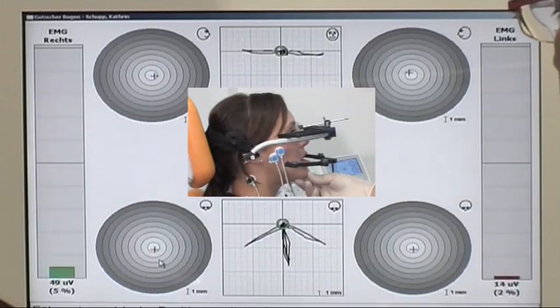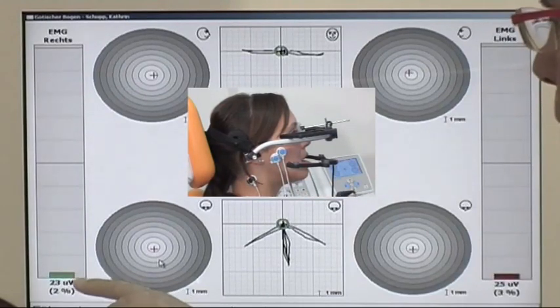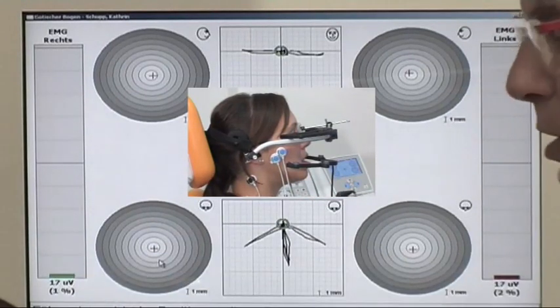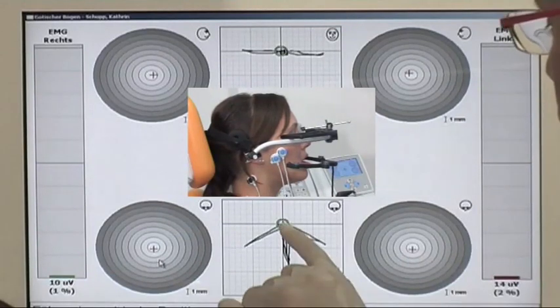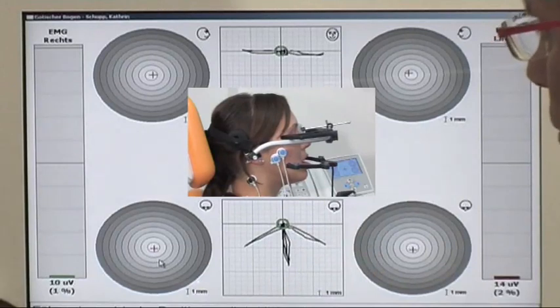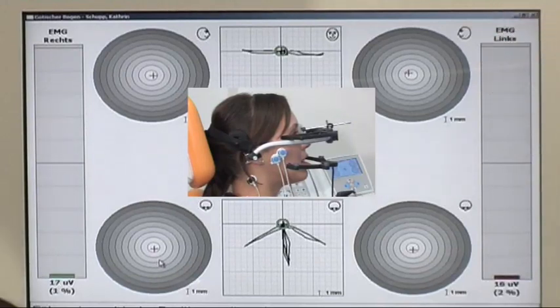Measuring is restarted, and she tries to maintain the lowest possible action potential, which means to relax as best as possible. Also, she has retrieved her centric position very quickly. Now we wait until the registration material is ready. Under ongoing control of the muscular activity and position, the material hardens. We have to wait for a few minutes.